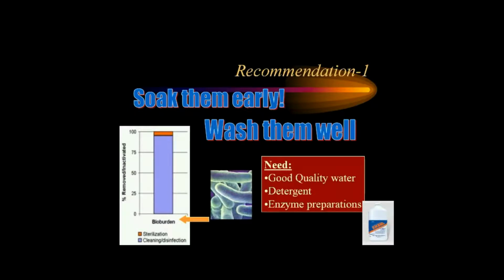Most of these germs can be eradicated by simply washing them well.